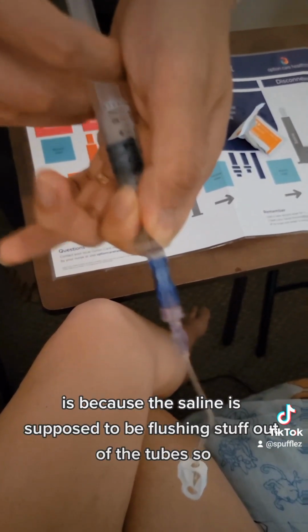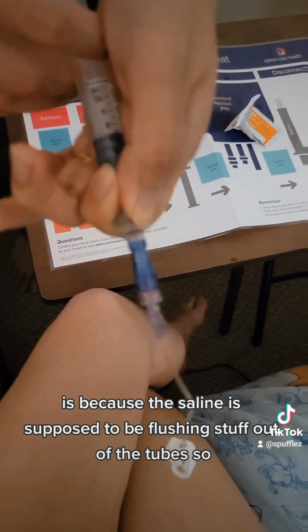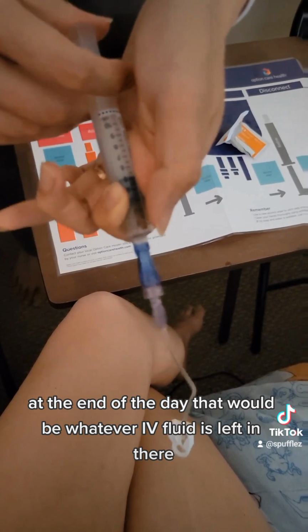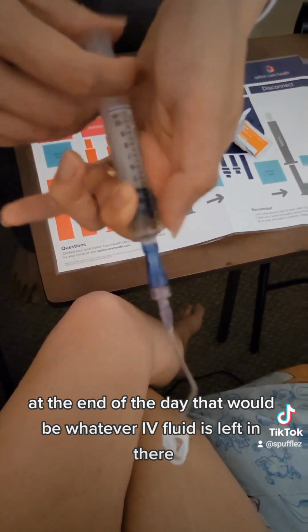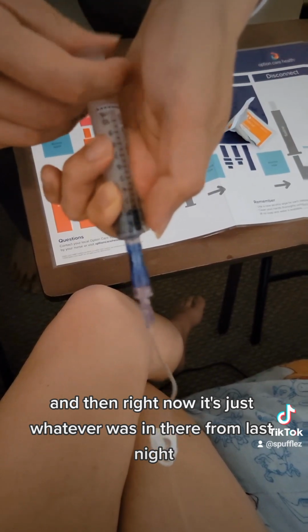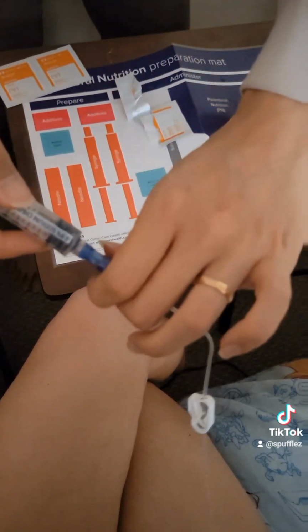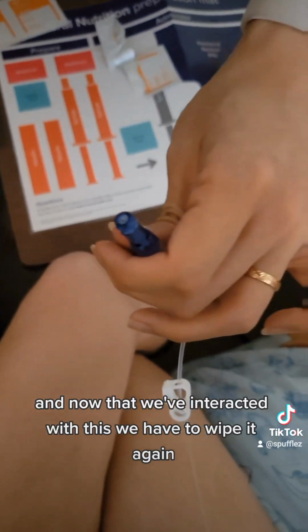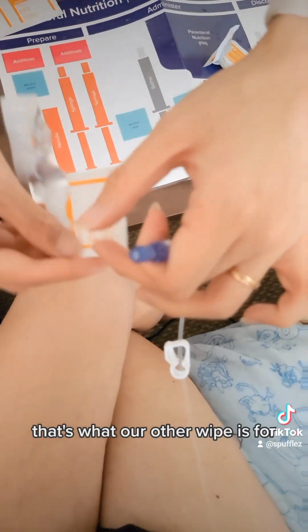It's because the saline is supposed to be flushing stuff out of the tubes. So at the end of the day, that would be whatever IV fluid is left in there. And right now, it's just whatever was in there from last night. So we clear things out. And now that we've interacted with this, we have to wipe it again. That's what our other wipe is for.